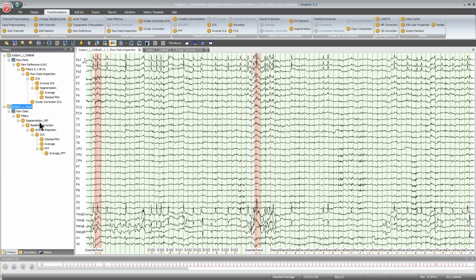In that case, I would maybe rather remove these epochs that contain the blinks. But generally, it doesn't matter. ICA doesn't care about continuous or epoch data. And the last question for today, I only have a short test paradigm. Can I simply use a very high sampling rate to increase the number of points for better ICA results?